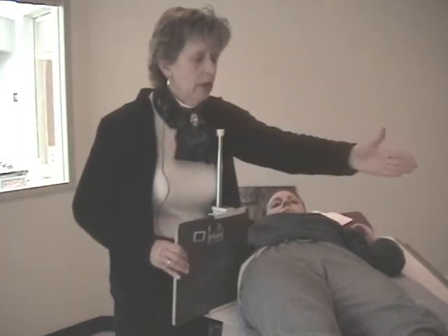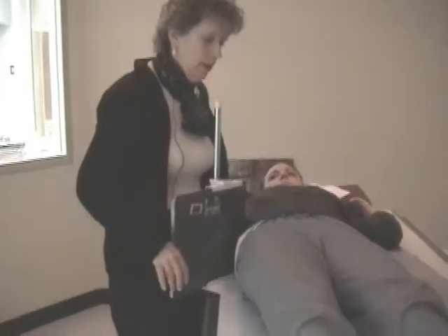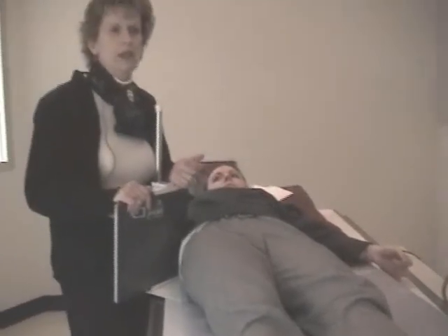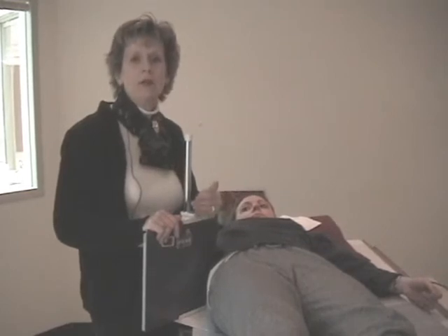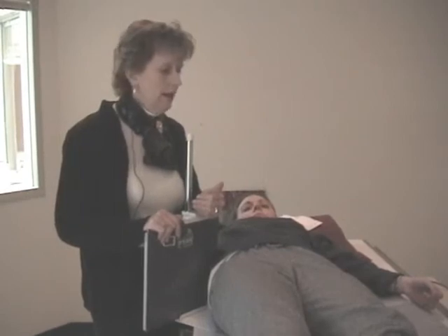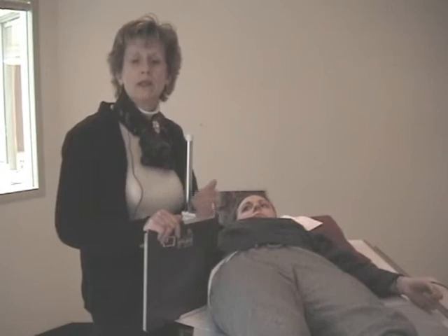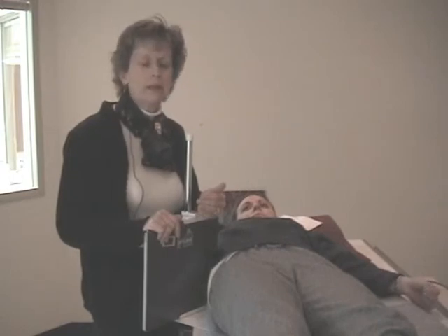I have my tube set almost to a parallel relationship, and this room is awkward to do cross-table laterals. It's a teaching institution, so we don't have the flexible equipment that you will in the hospital. So it's going to be best that you practice in the hospital with the overhead equipment, and you'll actually find in the department that when a trauma hip comes in, certain rooms are selected over other rooms because of the mobility of the equipment. You'll have your favorite rooms to work in.